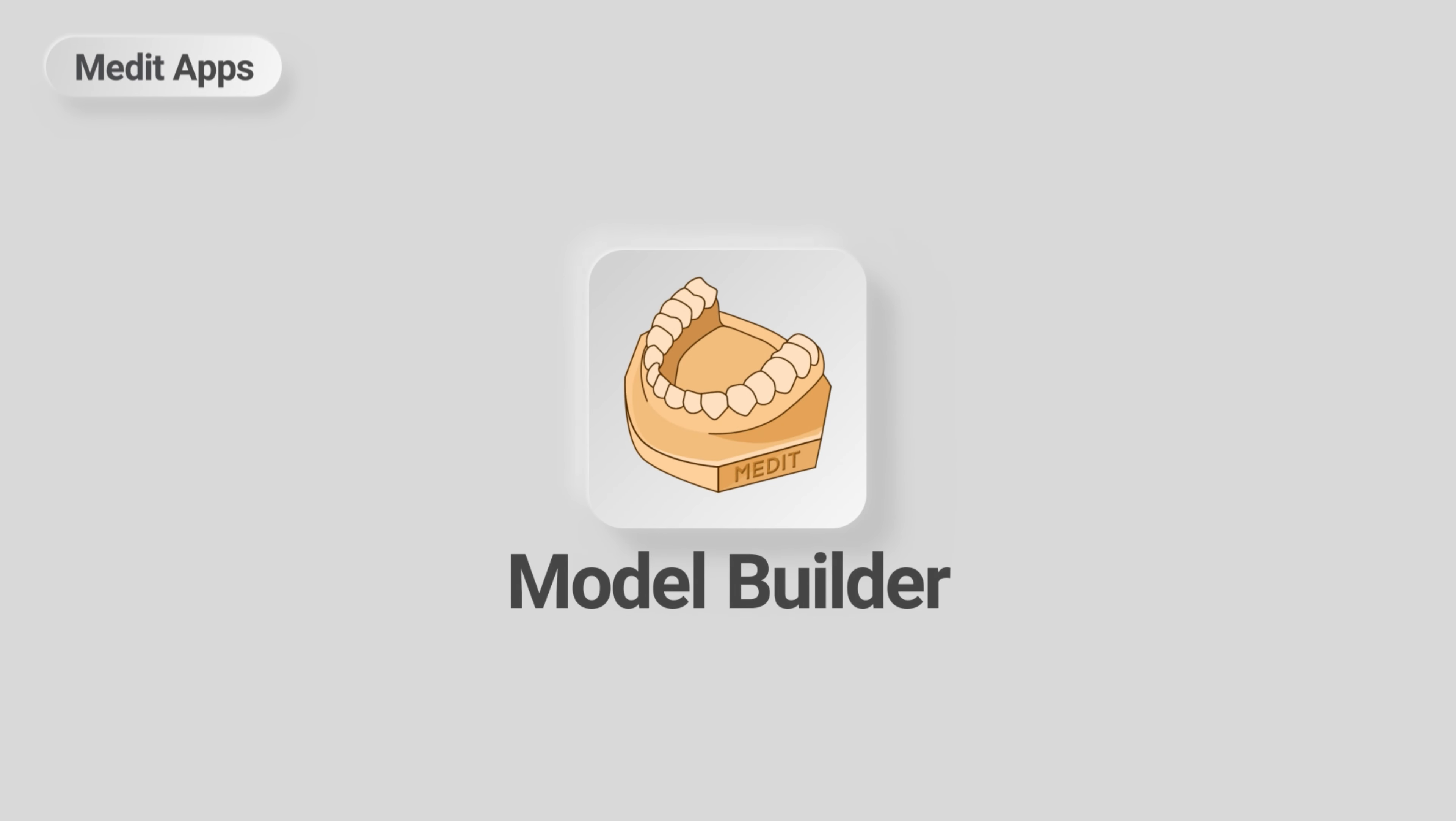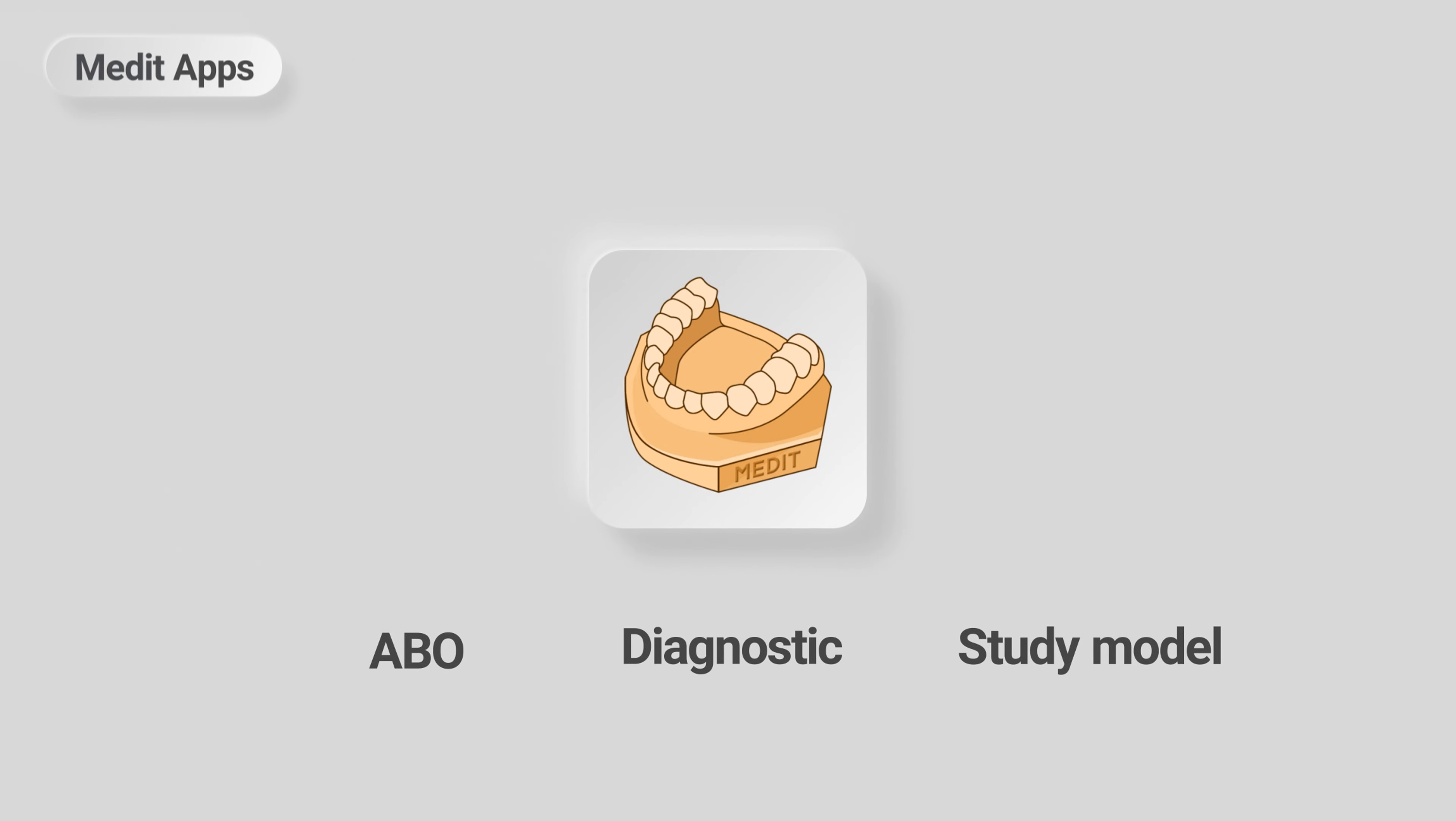This is a quick guide on how to design ABO models for printing using the Model Builder app.